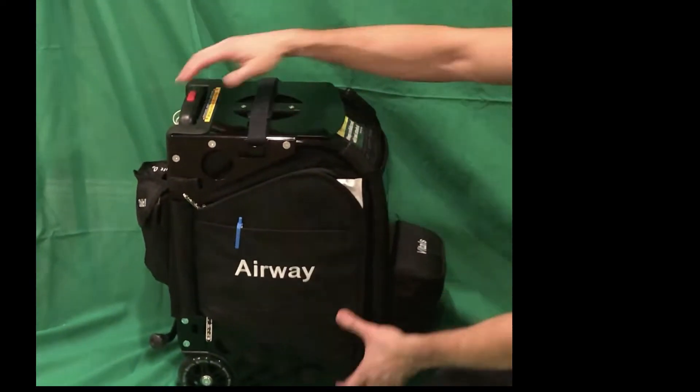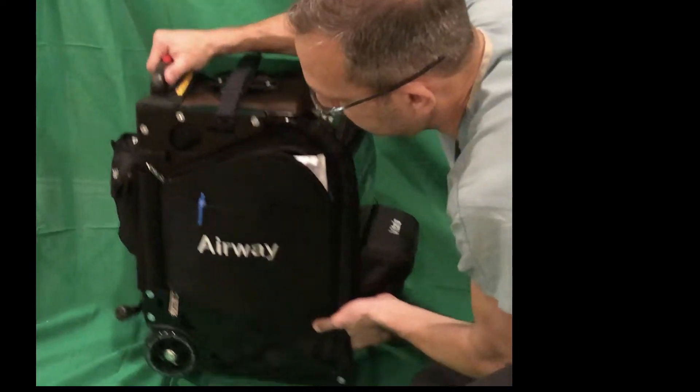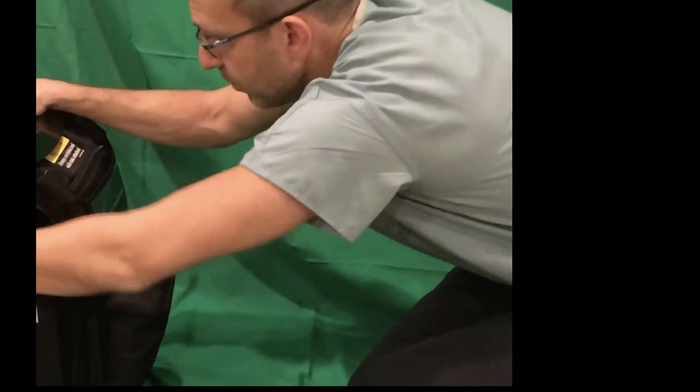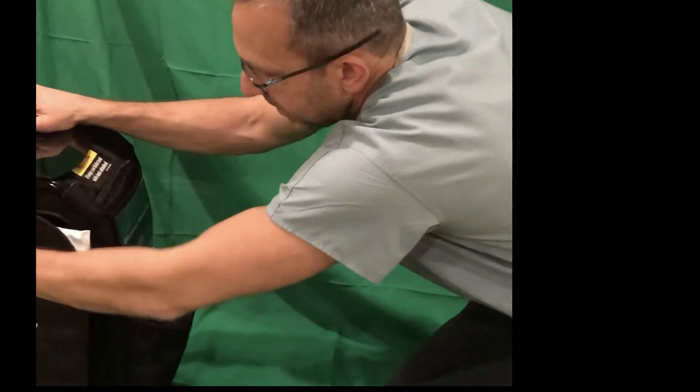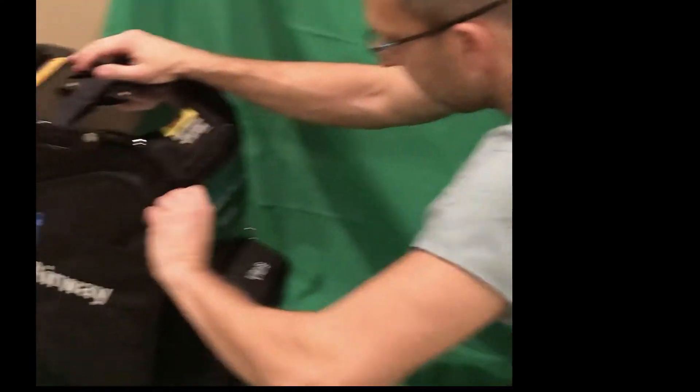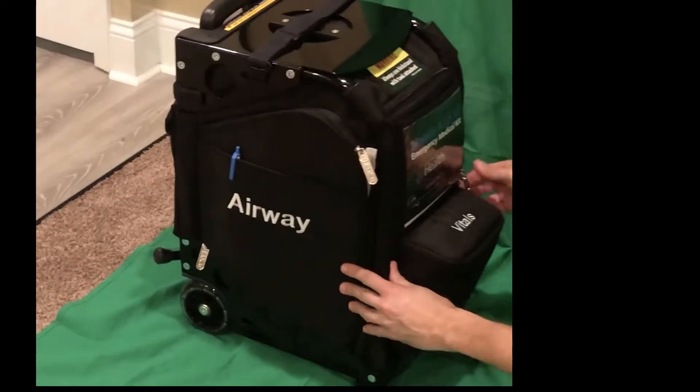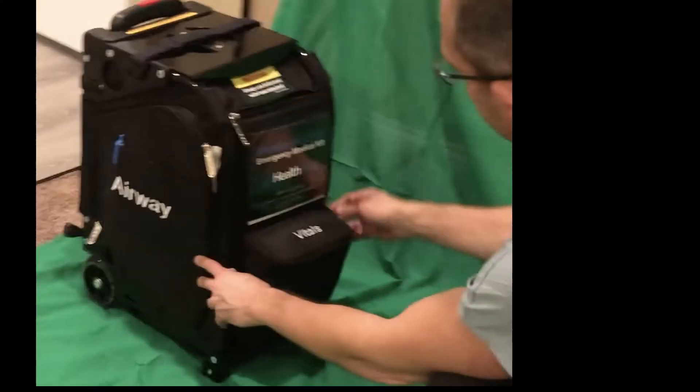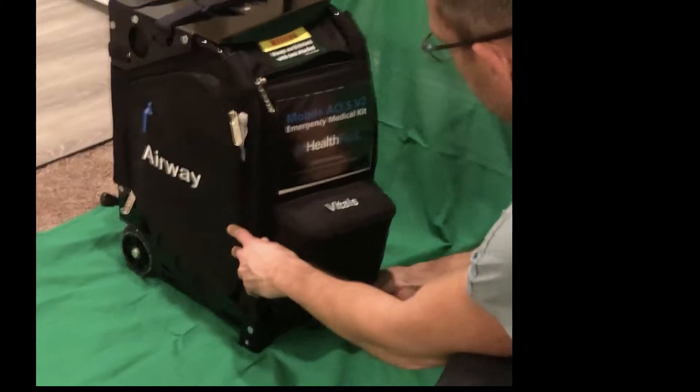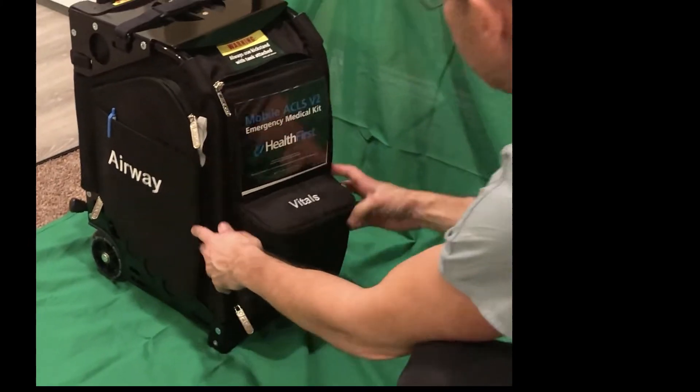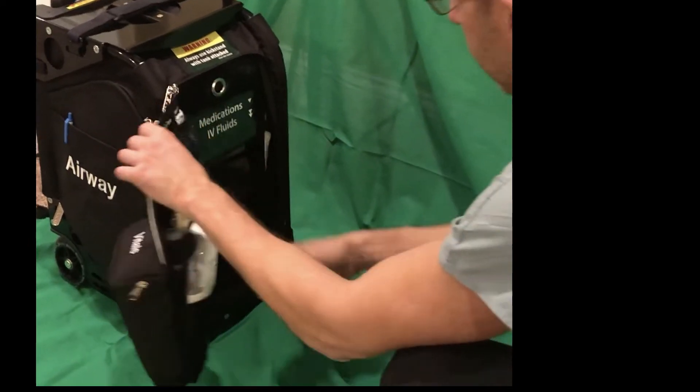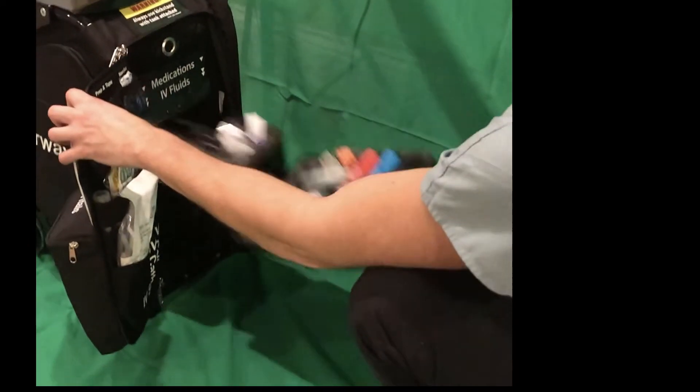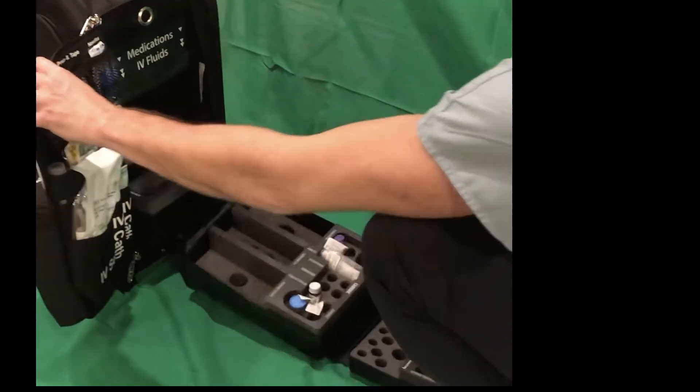Let's look at the medication portion. If you want to access the medications, you would come to the front, unzip the medication compartment, and just pull them straight out.